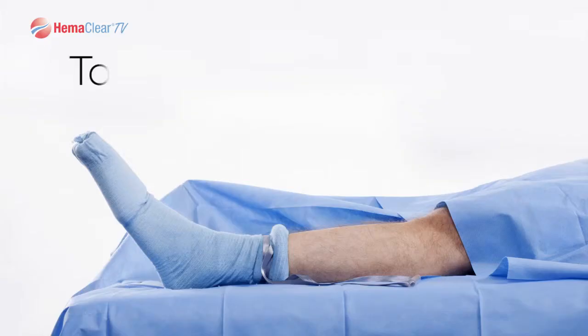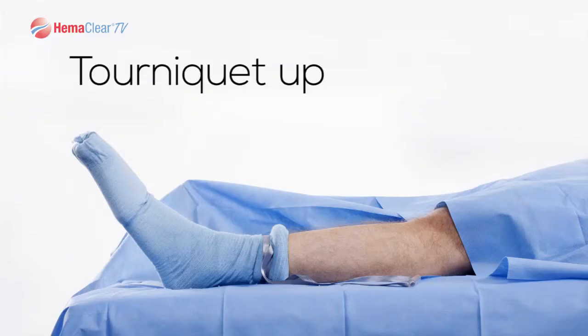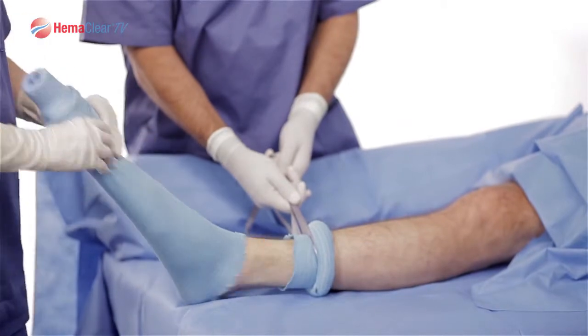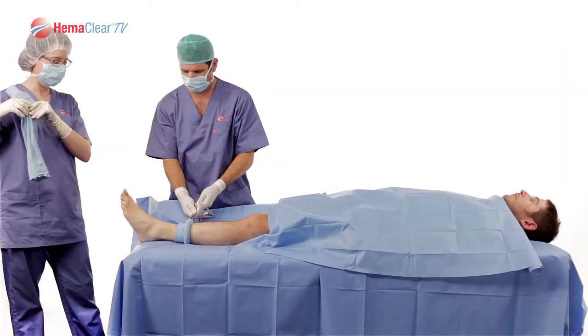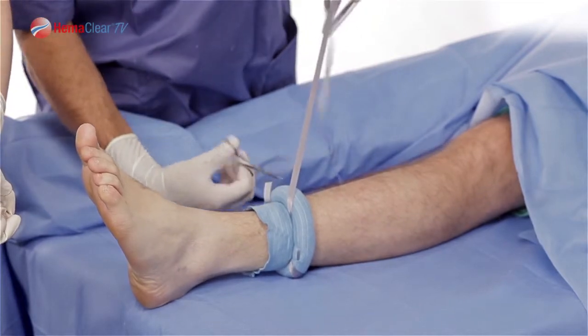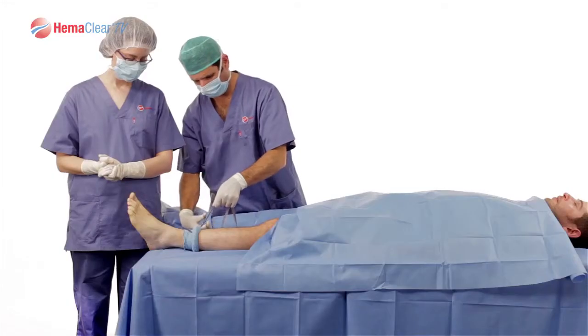Dictate the tourniquet time. Once Hemoclear has reached the desired occlusion location and the tourniquet time has been recorded, remove the Model A cup, exposing your surgical area. To start your procedure, simply cut the ribbons off. You are now ready to begin your procedure.